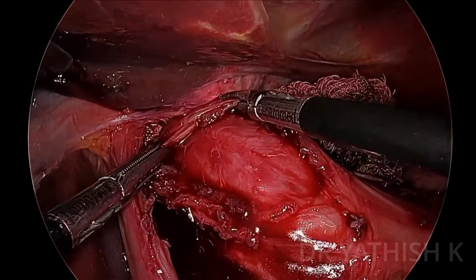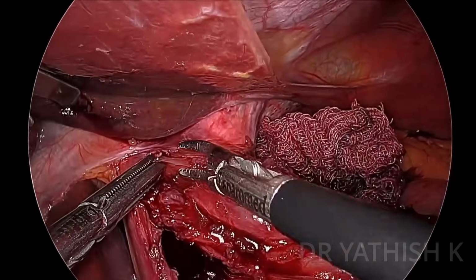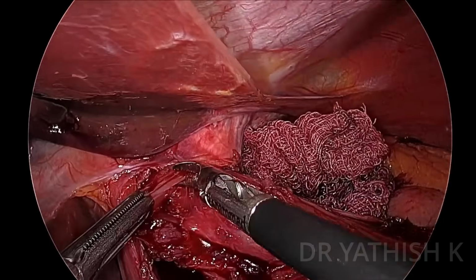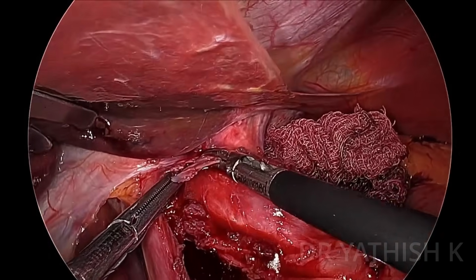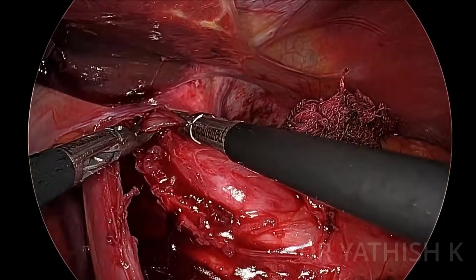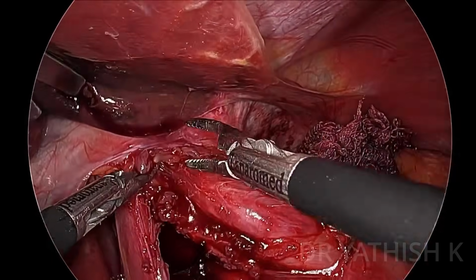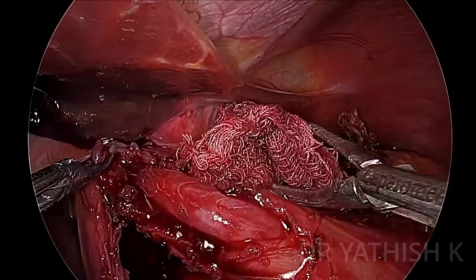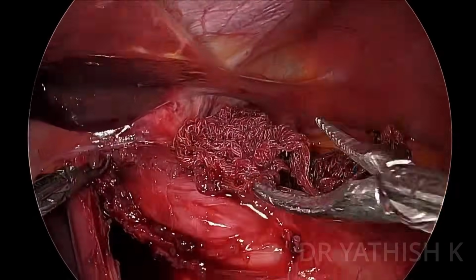If at all you use an energy device, you can use a harmonic. Make sure your active tip is not facing towards the mucosa. Instead, the active tip should be placed over the serosal part of the esophagus. So these are a few tips on how you have to do a proper esophageal myotomy. One more thing about using a Maryland is you have your curved part where you can create a tunnel between the mucosa and the muscular layer, which will help you in the myotomy. So you see, I didn't use any energy device here.